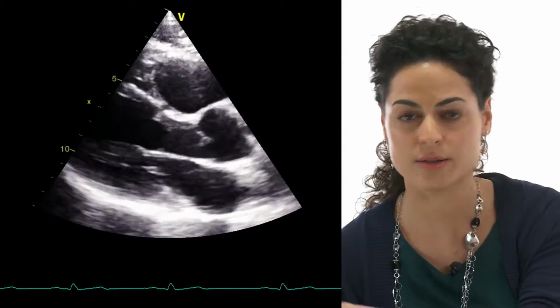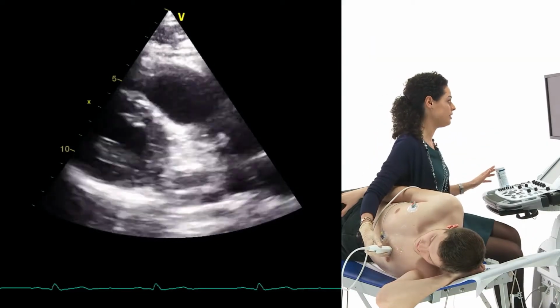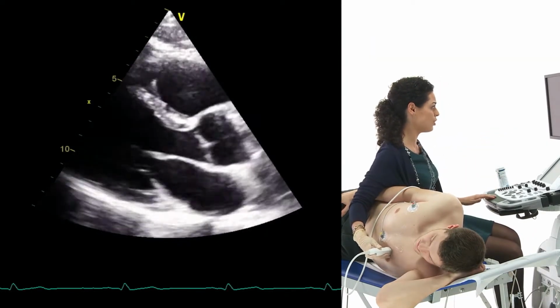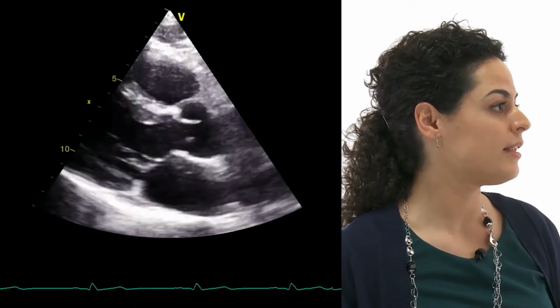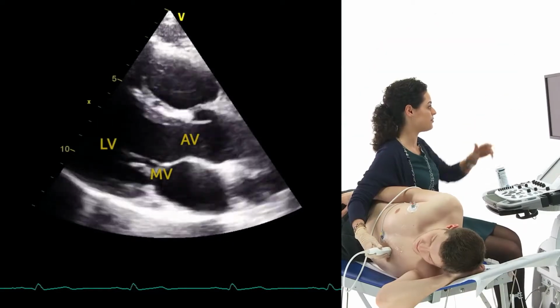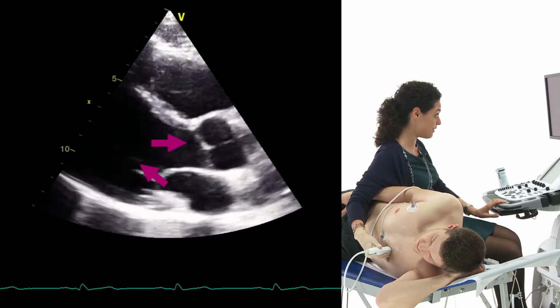I recommend once you see where the transducer is, just focus on your echo machine and the image you have and adjust it. So don't look at the chest of your patients again. How should it look like? It should really well show you the aortic valve and the mitral valve together with the ventricle. So you will have the inflow and the outflow of the left ventricle.